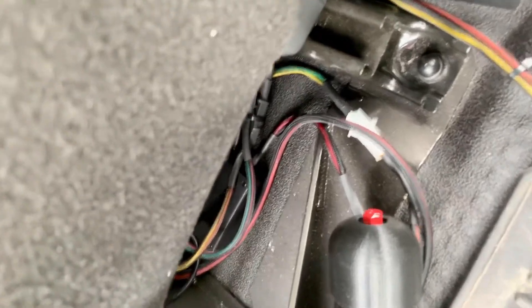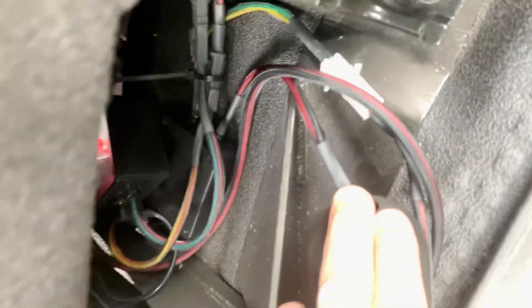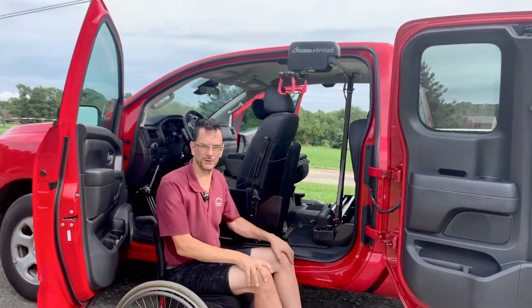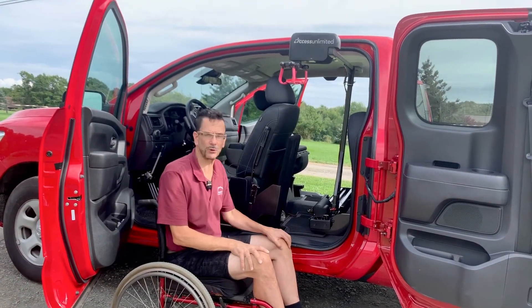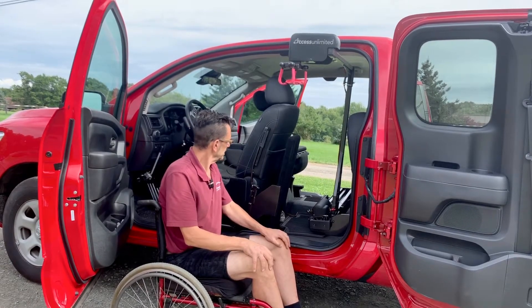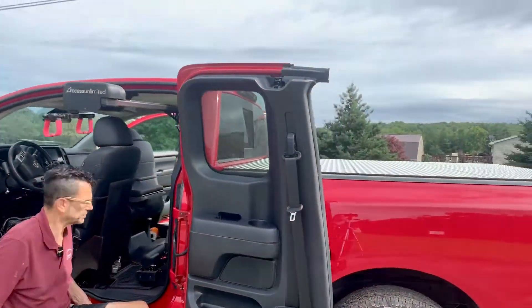The same thing applies to the Glide and Go itself. You can see right here there is a hole for the backup system, and that allows you — with some assistance — to run the Glide and Go up and down if there should be a problem where your battery dies in your vehicle. It's always important to have a backup system for everything that you do.